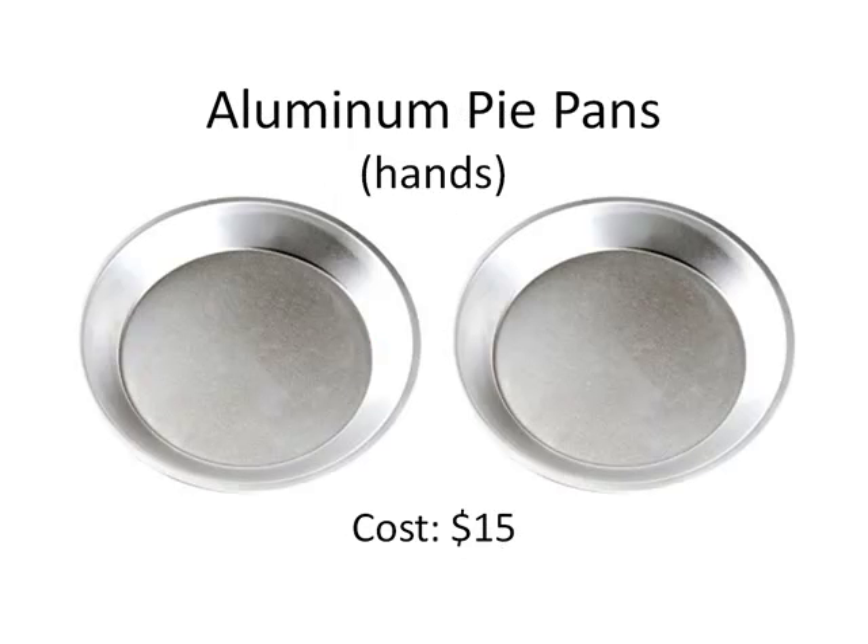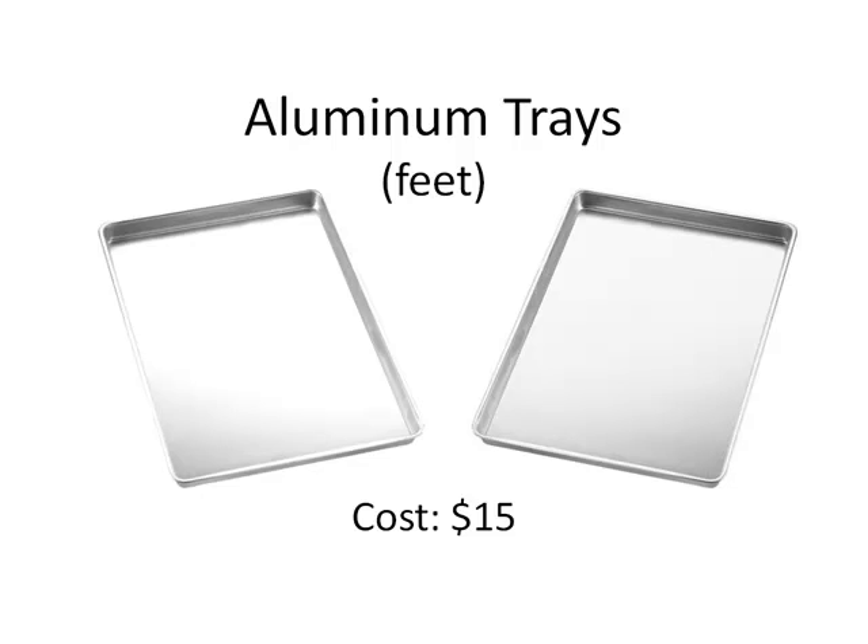You're also going to need aluminum pie pans. The pans are going to conduct the current from the battery to your hands or feet using the alligator clips. You can use any kind of pan that conducts electricity, but I do recommend getting pans that are durable versus disposable ones — it'll save you more money in the long run. The pie pans shown in the video won't oxidize and can be picked up for $15 or less. If you plan on doing this treatment on your feet, you'll want larger pie pans. For this demonstration, I'll be showing how to perform iontophoresis on your hands, but the exact same procedure applies for sweaty feet.